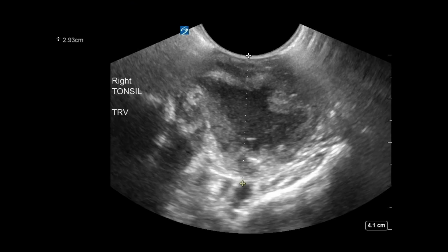On top of that, you can actually measure the distance to the carotid. I really like this because for those of you that do needle aspirations, you can measure and give yourself a safety factor. You can measure to the carotid, measure to the posterior wall of the abscess, and give yourself a little bit of a shield so you can make sure you're not going too deep. You don't want to get an ABG out of doing a peritonsillar abscess drainage. That's poor form.